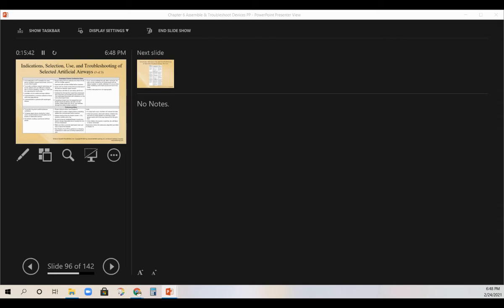So tracheostomy tubes, proper sizing is critical. That'll be in chapter 9. We've maybe touched on it a little bit. It's for long-term positive pressure ventilation. Inflate the cuff to confirm integrity before intubating. You always want to check that. Remember, we always check position the same way we do with the ET tube. Make sure a correct size spare inner cannula is kept by the bed. We always want to do that because if they end up pulling it out or we lose a cannula or anything, we want to make sure we can get it right back in.